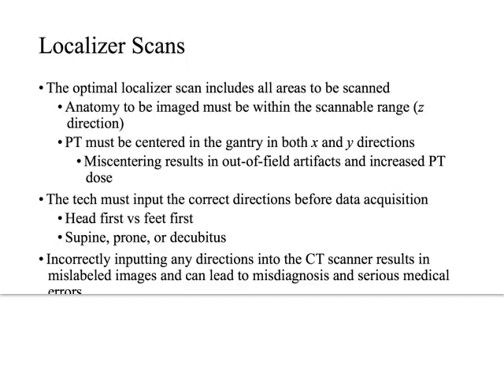And that's what it's talking about with this information here about how you can tell the machine, is this person head first, feet first, prone, supine. It's very easily illustrated with a cartoon graphic on almost every scanner because they don't want you to screw that up. So they're going to make it as simple as possible to look at this little dude, flip him around, and make sure that it's right.